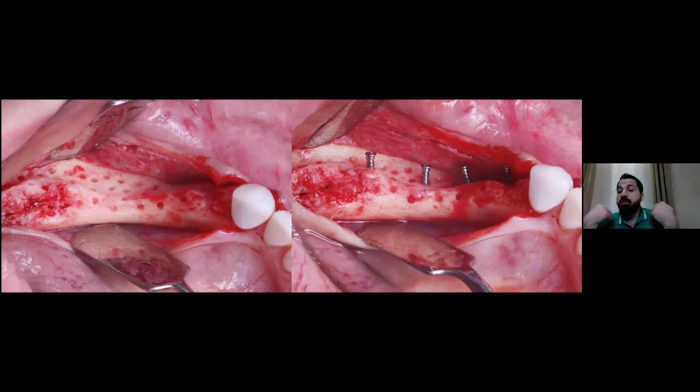So we're going to place our tenting poles not more than 4 to 5 millimeters. Unfortunately, I did not take a lateral view in this case, where I will place my tenting poles 45 degrees inclined, 4 to 5 millimeters out of the bone, and it will not be going off of the crest. So it should be at the level or below the level of the crest.